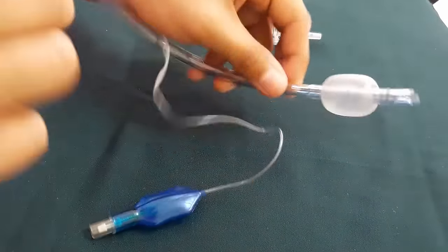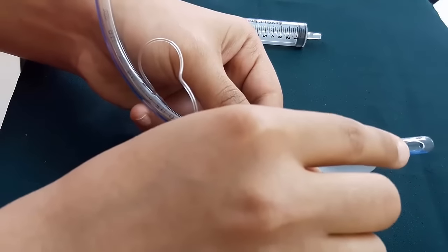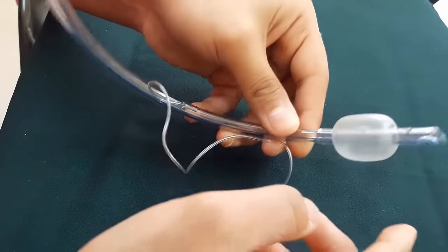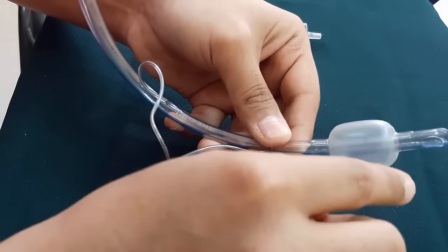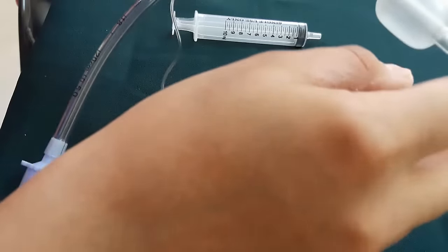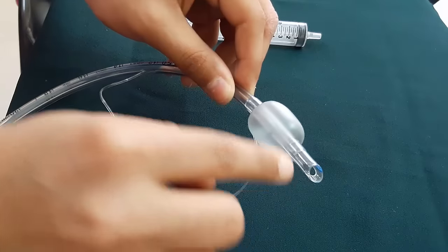Now we talk about the distal end of the ET tube. As you can see, there is Murphy's eye. The purpose of Murphy's eye is that if the main opening of the ET tube gets blocked with blood, pus, or secretions, gas flow still continues through Murphy's eye. If Murphy's eye were not present, the ET tube would be completely blocked.